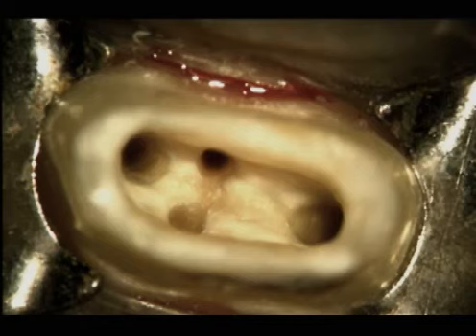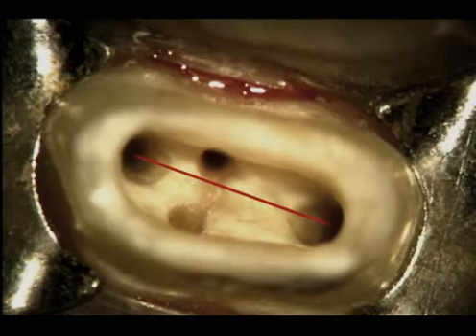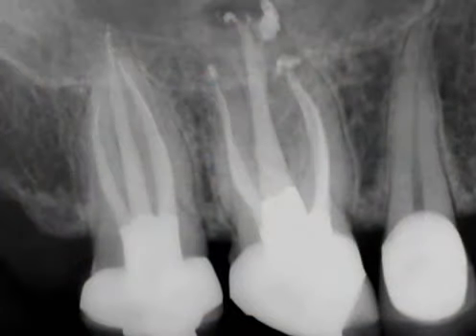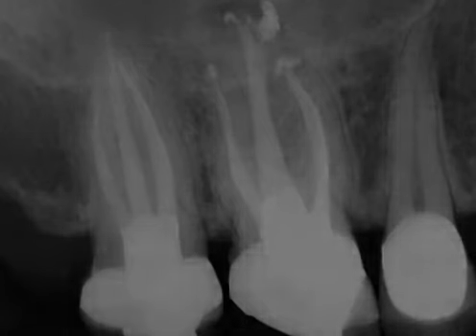Traditionally, we've always taught clinicians that the extra canal is on an imaginary line between the MB1 and palatal orifices. In reality, the MB2 is always mesial to that imaginary line, and access cavities need to be modified accordingly. The postoperative radiograph demonstrates non-surgical retreatment has addressed the root canal systems.